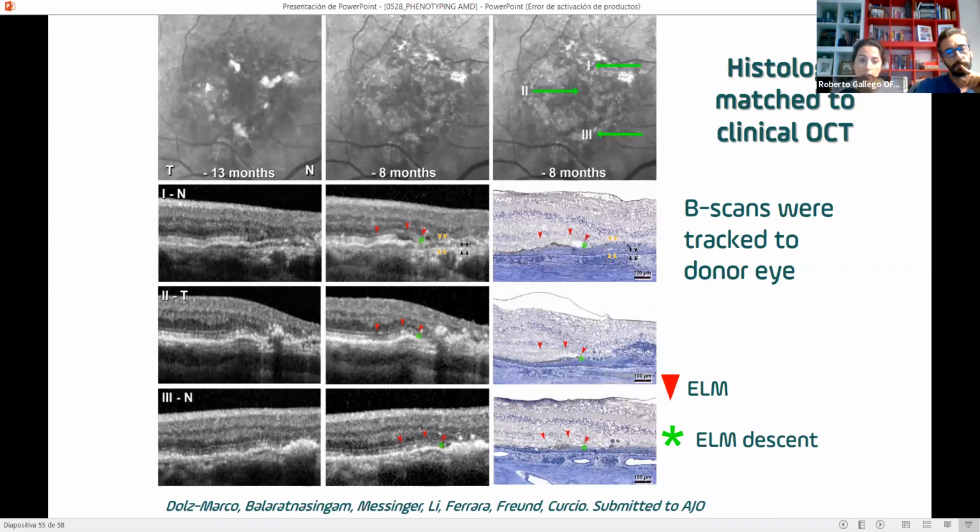Sometimes we don't have a clear margin on the atrophy of the RPE, and we have areas of hyperautofluorescence that are not clearly defined as atrophy or not. So we can add this feature to really see if we can add information.